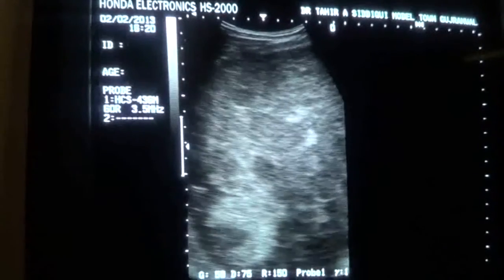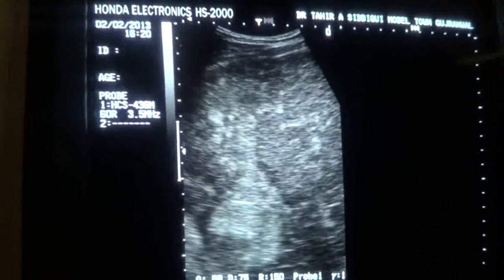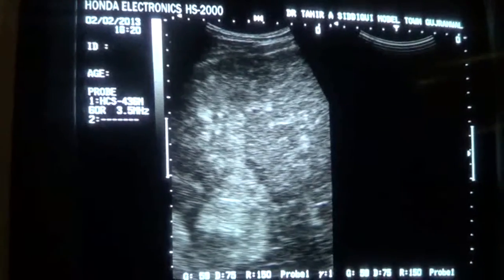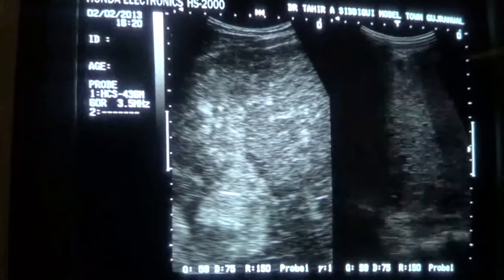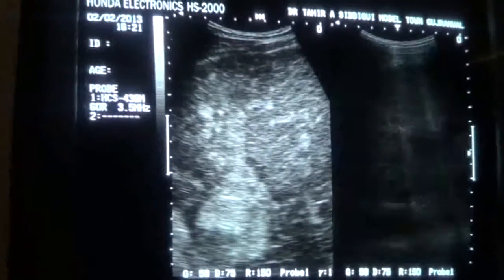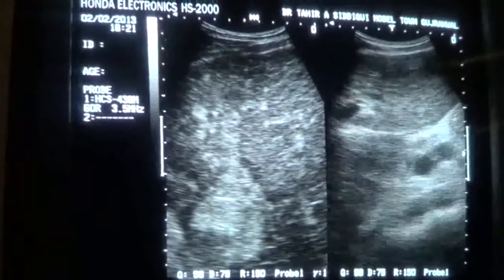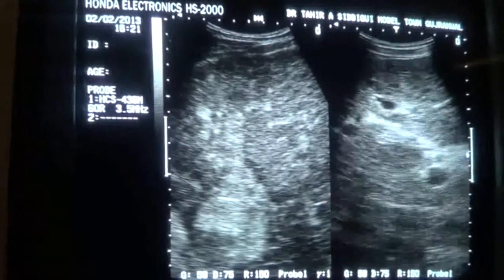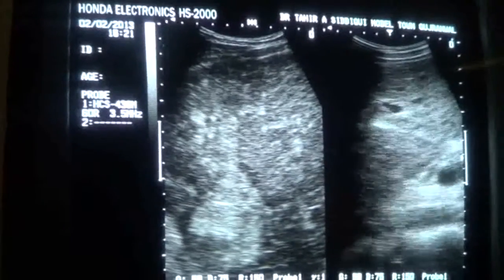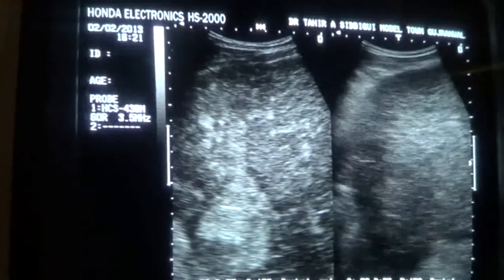These are nodules, macronodular cirrhosis with hepatoma and with numerous mets within it, as well as hyperplasia of the caudate lobe of the liver, also involved in the metastatic process as well as the cirrhotic process.